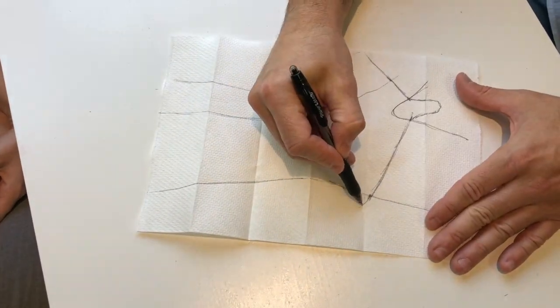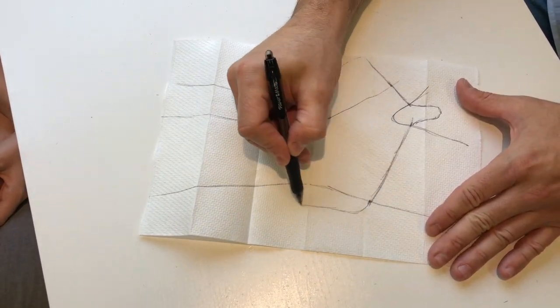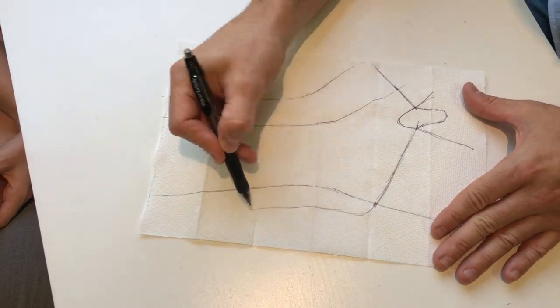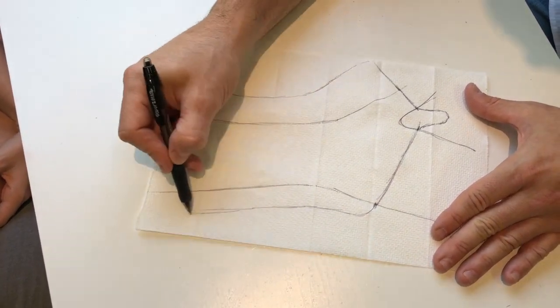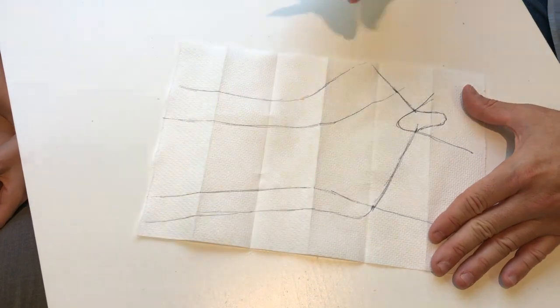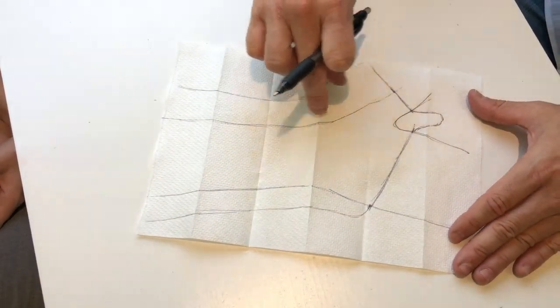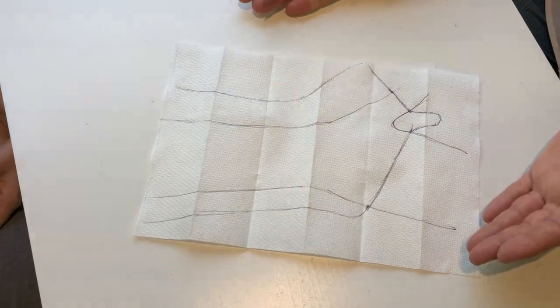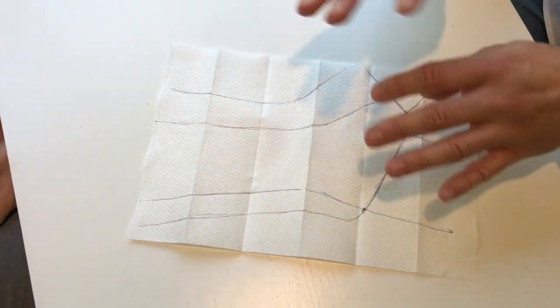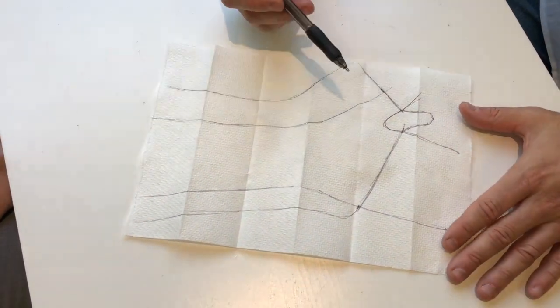On the ulnar side, we do exactly the same as we've done with our thumb hole, keeping it pretty consistent, two to three centimeters of extra width. You can see we have a lot more thermoplastic on our radial side, which gives us nice circumferential support, which is what we're after.